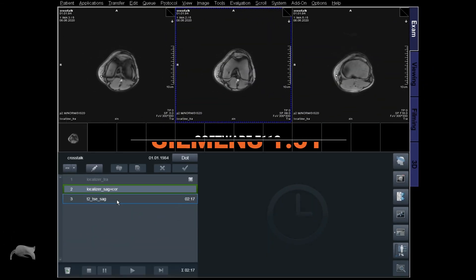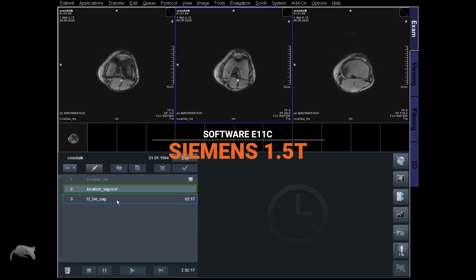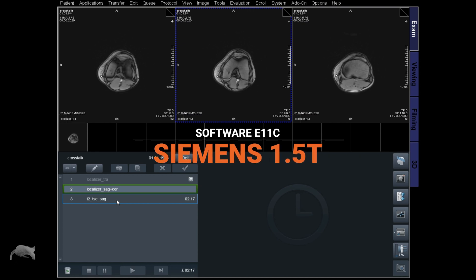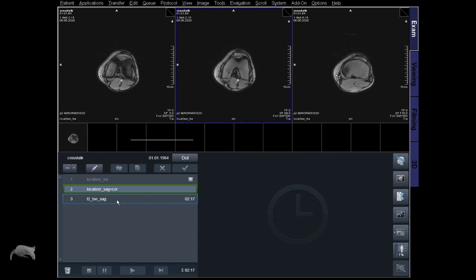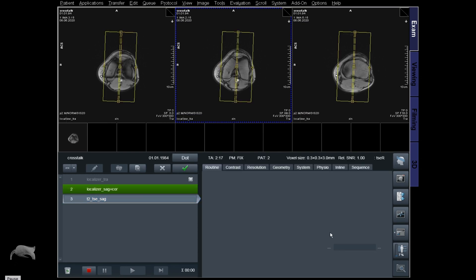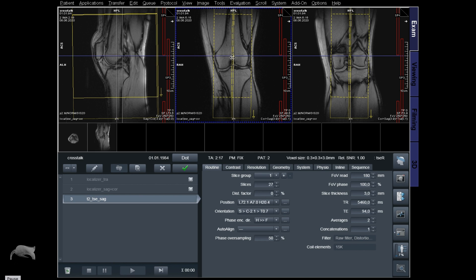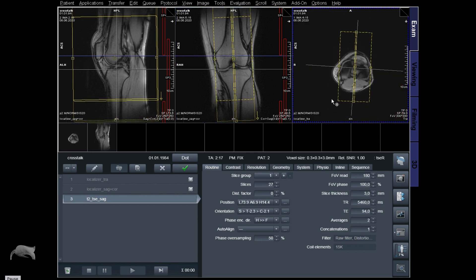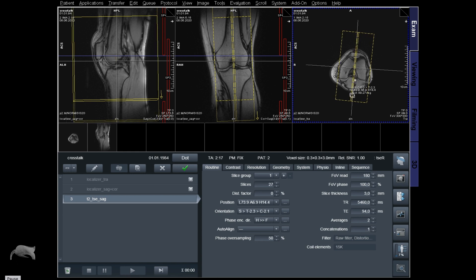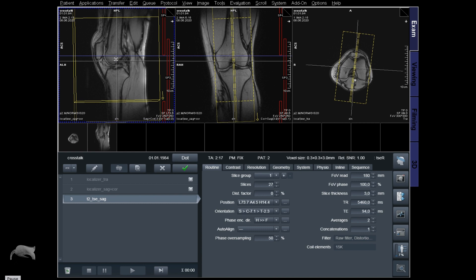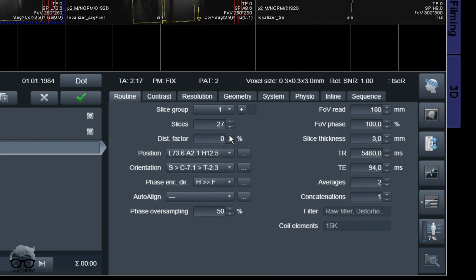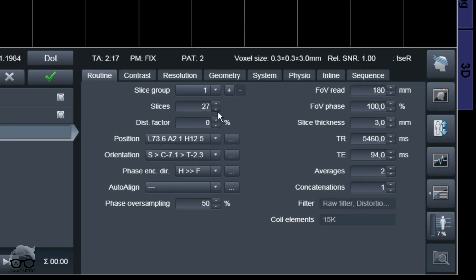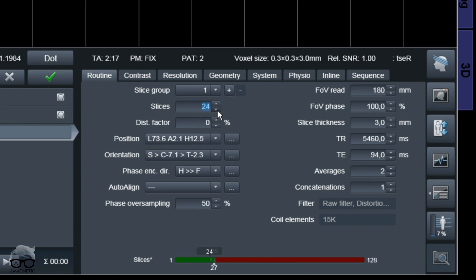We are currently at the 1.5 Tesla, but it doesn't matter what field strength you're at — crosstalk will occur either way. I'm just gonna do a simple knee imaging here. I'm gonna localize it right there, open a T2-weighted sagittal, and use the sagittal to demonstrate this crosstalk effect. It will be easier for us to do some measurements and comparisons at the end of this session. First I'm gonna reduce a few slices here to save a little bit of scan time.